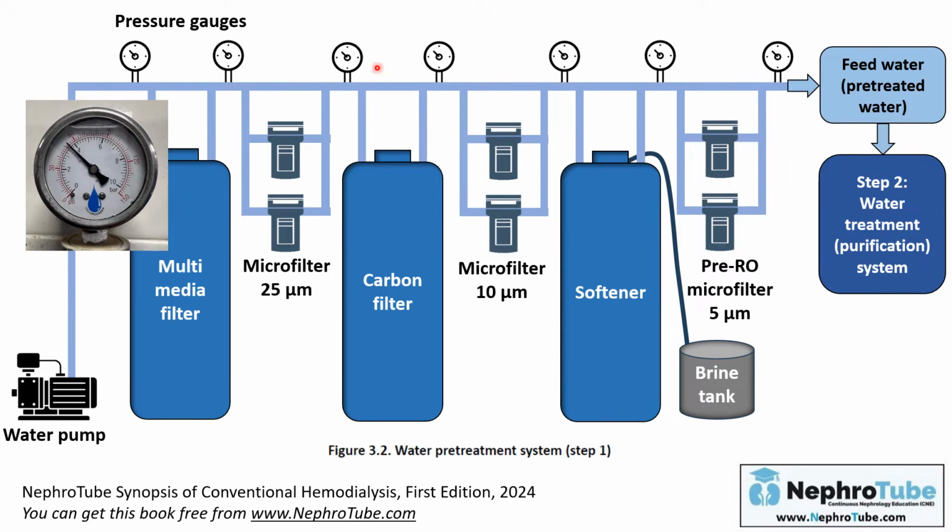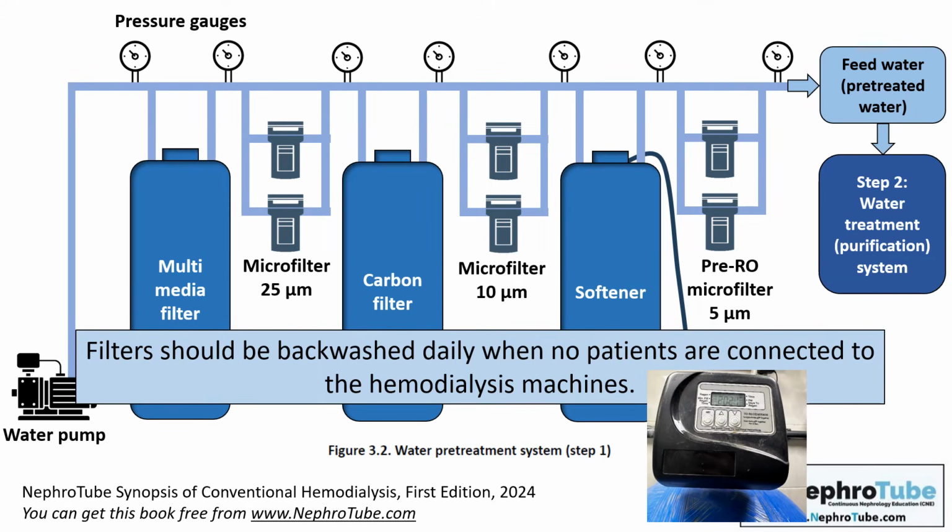So if there is a difference in this pressure, or even periodically, filters should be backwashed at least daily when no patients are connected to the hemodialysis machine. And this is a photo from one of tanks here in Egypt.